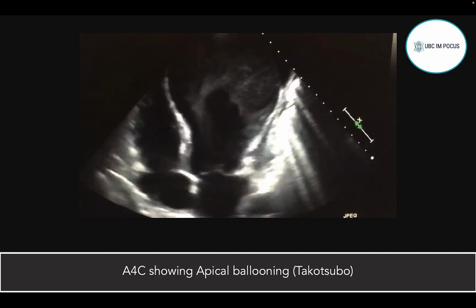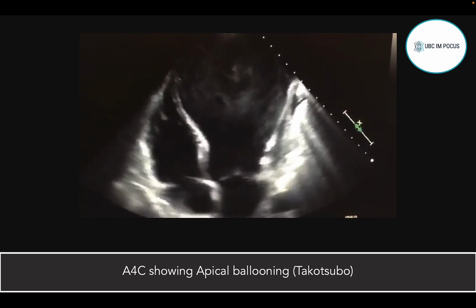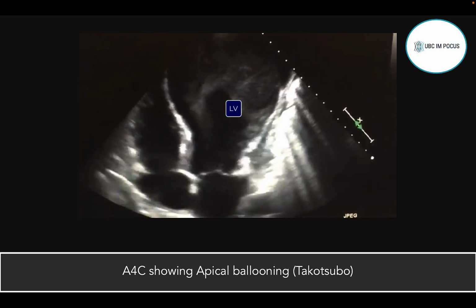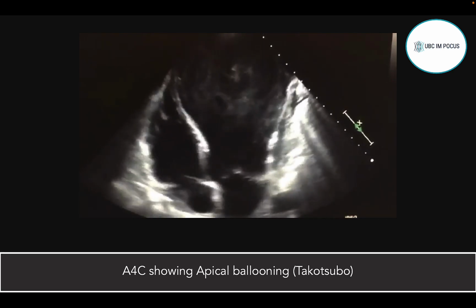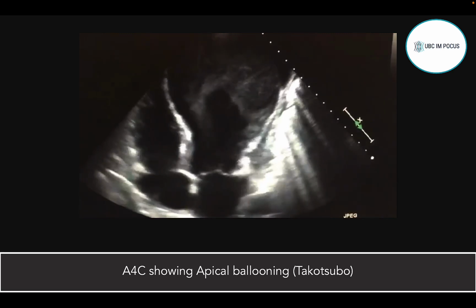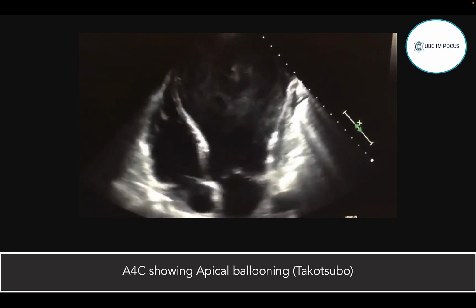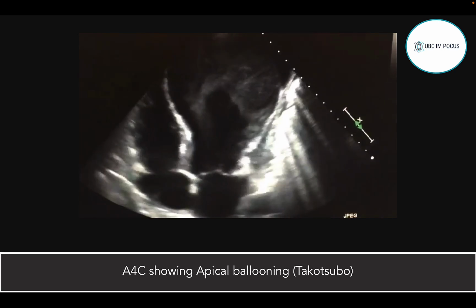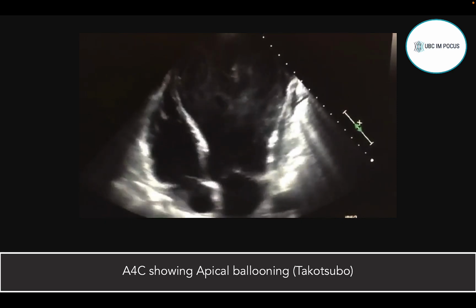This is a really impressive echo image. We've cut off a little bit of the bottom of the atria, but the obvious impressive thing here is the left ventricle and this really dramatic ballooning of the apex. And you can even see some swirling of blood there. We see that sometimes when there's really stagnant blood flow, and you can see how this would be a risk factor, for example, for LV thrombus and clot formation. So this is an example of Takotsubo. This is the classic morphology, apical ballooning and preserved basal contractility.